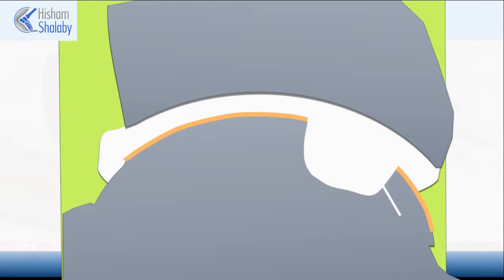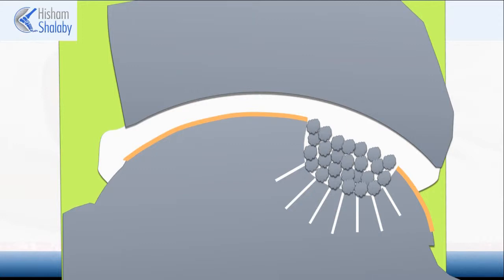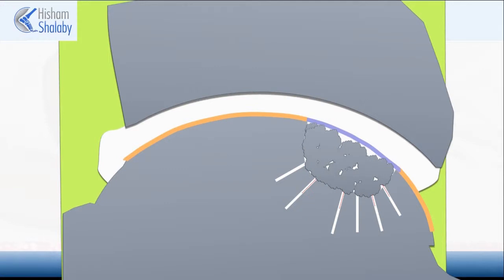The bed of the lesion is then drilled with multiple drill holes. The defect is then filled with bone graft, usually obtained from the heel. The lesion is then covered by a collagen membrane. Blood travels from the healthier bone towards the lesion, and the bone graft starts to integrate with the surrounding bone. Cells from the bone graft gradually form a cartilage-like layer from the collagen membrane.